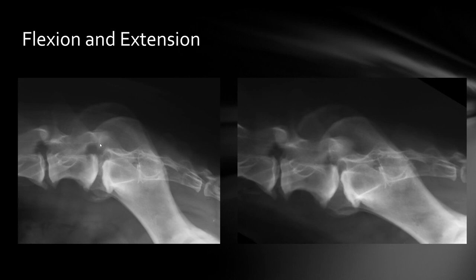I think it's pretty obvious just looking at this lateral view that there are degenerative changes and a pretty notable step between the vertebral canal at the caudal lumbar L7 here and the sacral vertebra. So this looks very abnormal even without the extension radiograph. So we don't do any stress views of the spine, period, nowhere. But I know some people still believe in them.